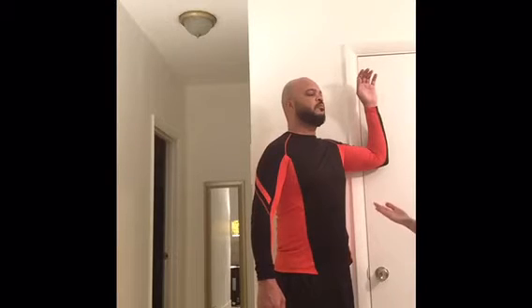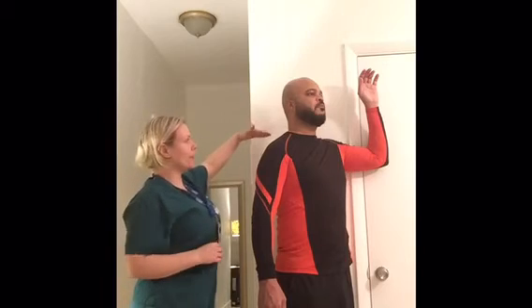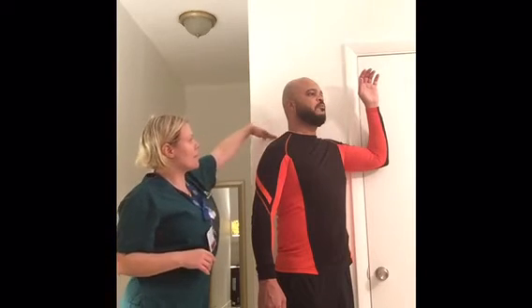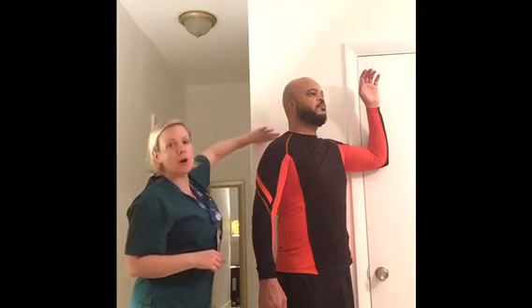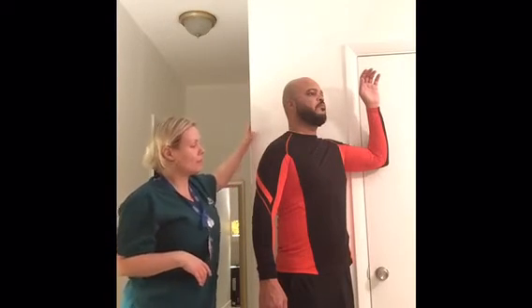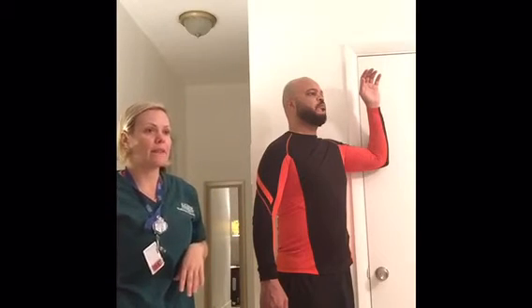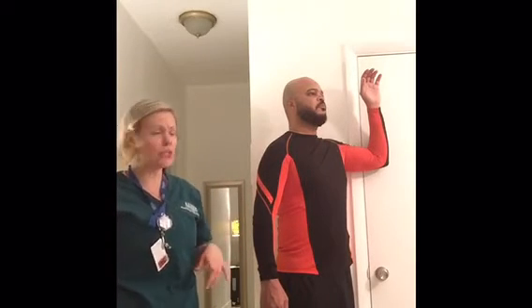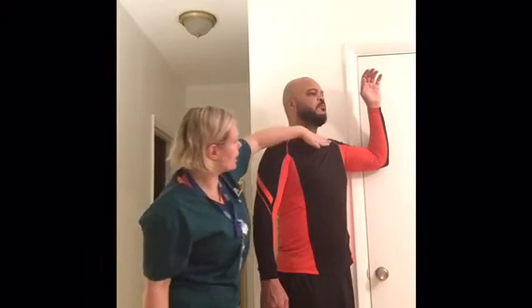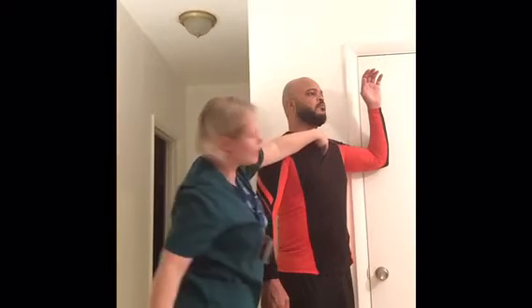Then again, in this position, we have to do 2 pictures, where one will be the upper. So again, in your light field, it has to be 1 inch. Again, the central ray will be the same. It has to be 3 to 4 inches below the jugular notch. So the jugular notch is here, so it will be about 6 fingers of mine. It will be about here.